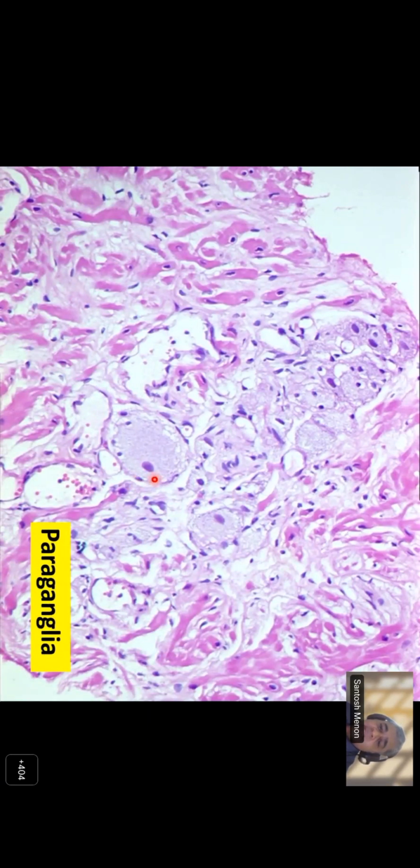If you start looking at nucleoli, the ganglion cells have prominent nucleoli, so you are likely to mistake them. But sometimes you are easily able to pick up the Schwann cell or nerve bundle kind of morphology within them, and then you're sure of what you're looking at. The cytoplasm is usually very amphophilic in appearance in this paraganglion. This is a seminal vesicle which may be inadvertently sampled in a prostate biopsy. The presence of lipofuscin pigment is helpful, but in a young patient, you may not have this wear and tear pigment, and that's when you look at the morphology of the cells; they look pretty bizarre.